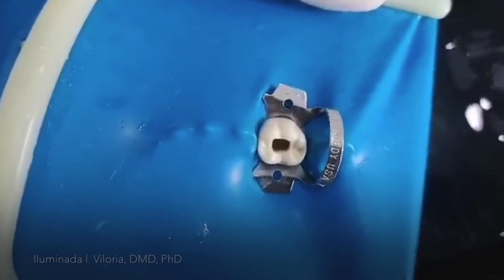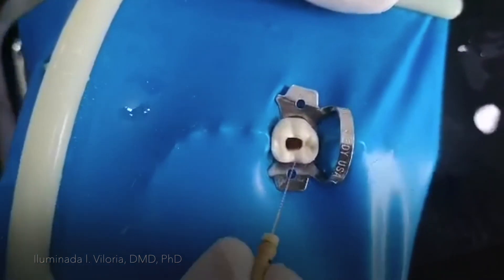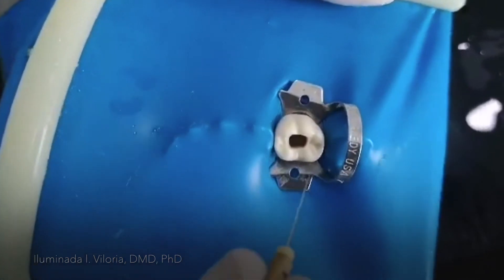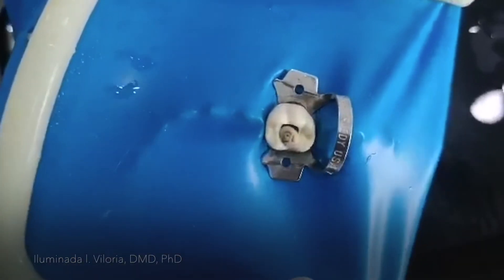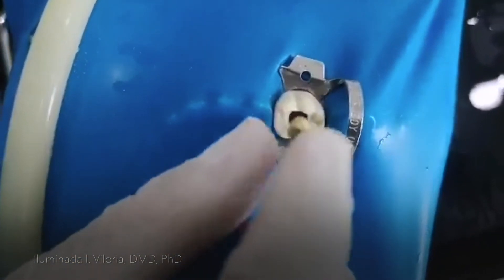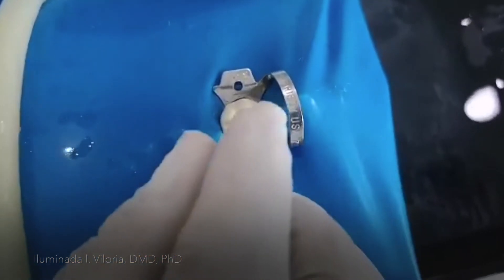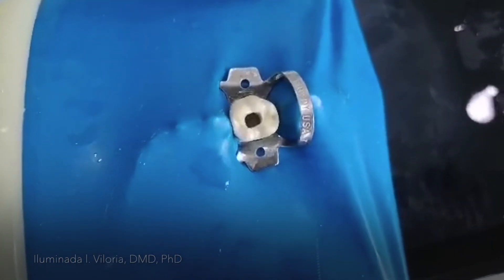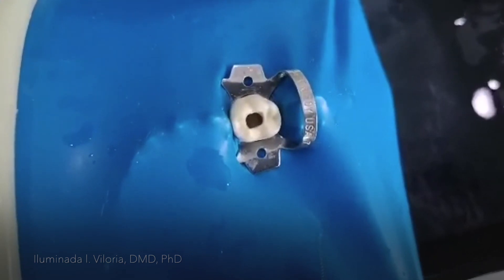In this case, since this is a typodont, they have recommended the use of size 15. I'll go to the mesiobuccal, then the mesiolingual, and then distal. So now you have completed the access cavity preparation of the mandibular first molar. Thank you.